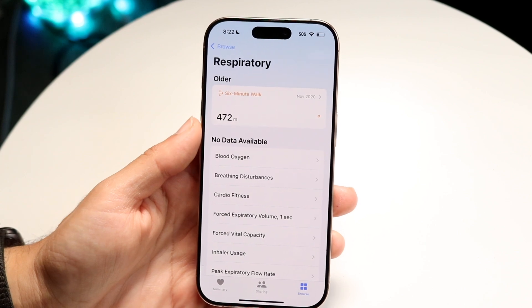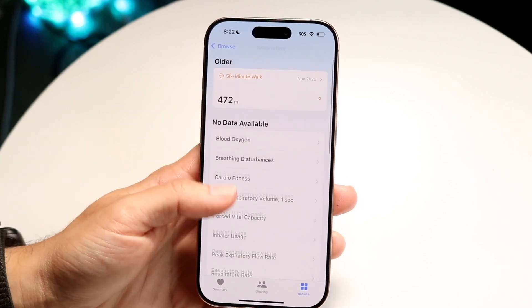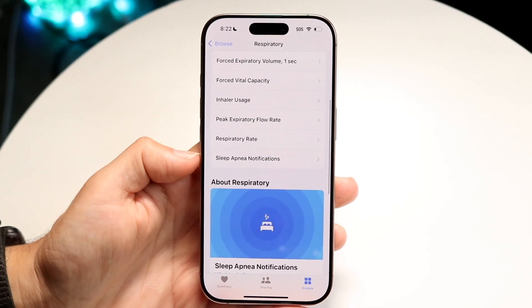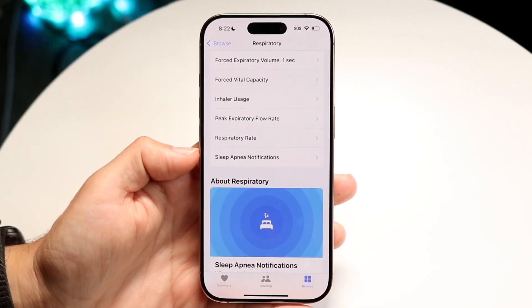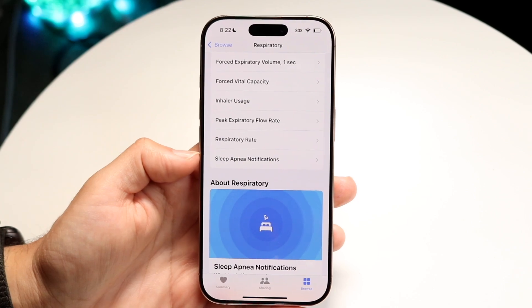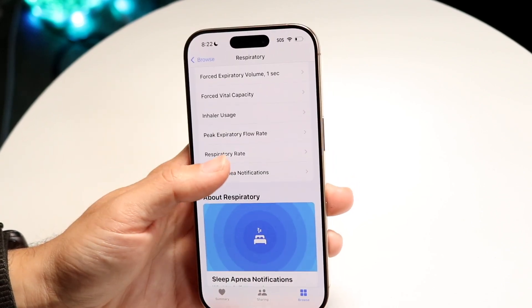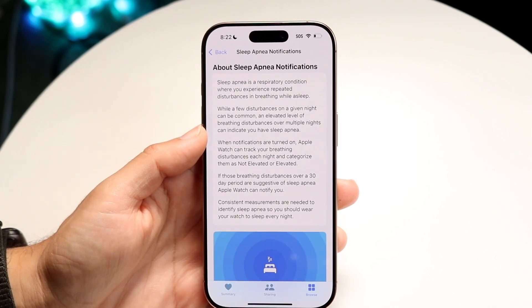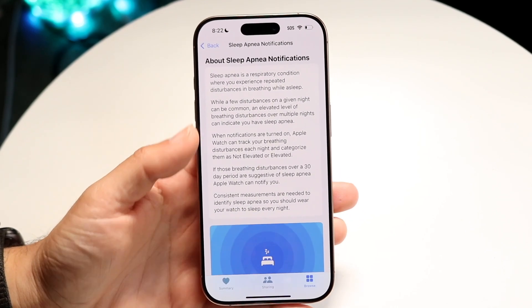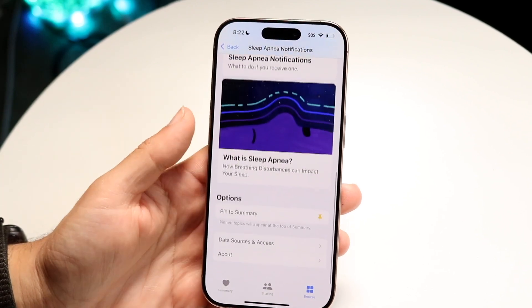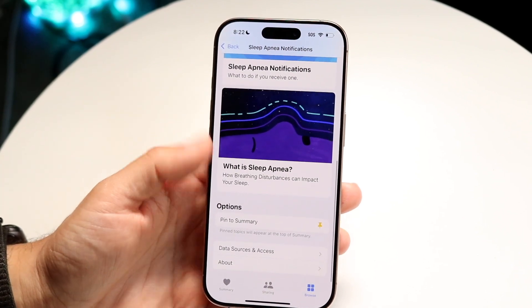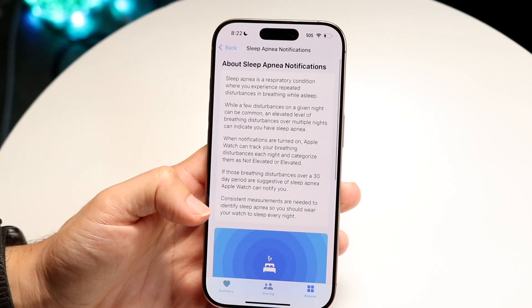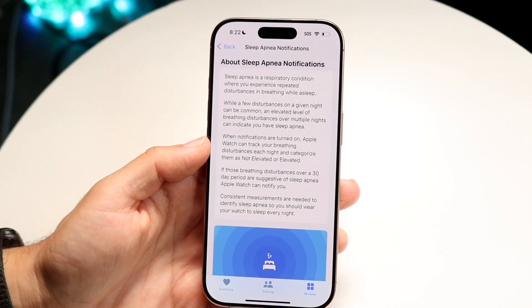When you tap on Respiratory, a bunch of options will come up. What you want to find is the Sleep Apnea Notifications option. Tap on it and a new page will come up with a panel that allows you to set up sleep apnea notifications.